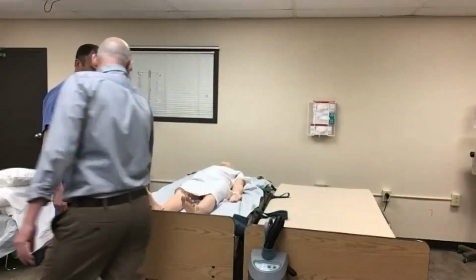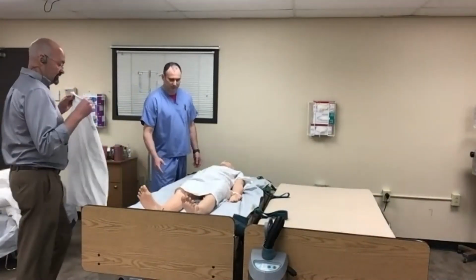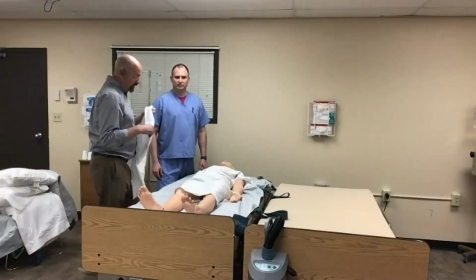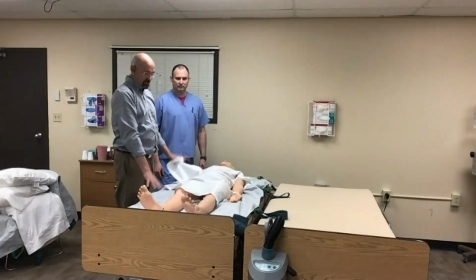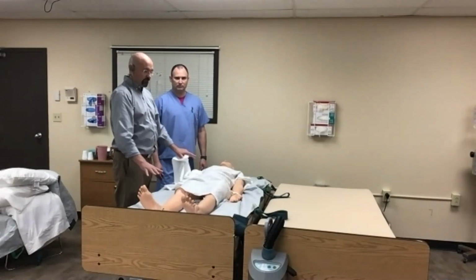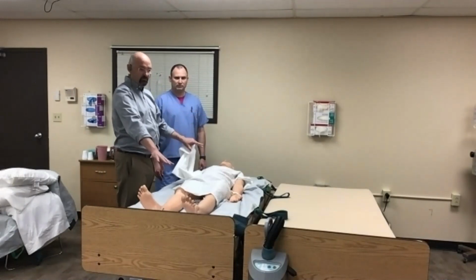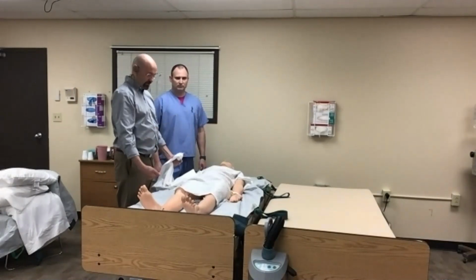The patient's already on it. One of the neatest tricks we do with this is an OR trick, using a pillowcase. Oftentimes we're going to be sliding him off. That surface is our stretcher. This is the bed they're on. We're going to lay him flat, transfer him over onto that surface, get this surface prepped with another HoverMatt or another air transfer device and pillows, and then prone him off of that surface onto this surface.